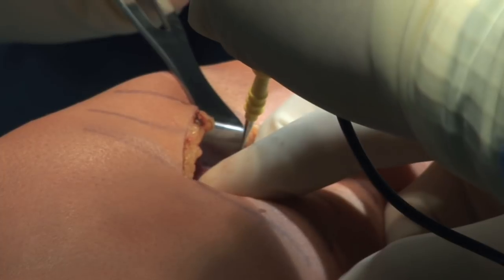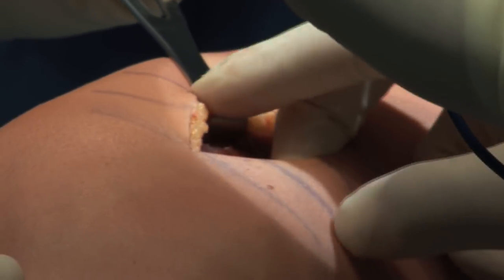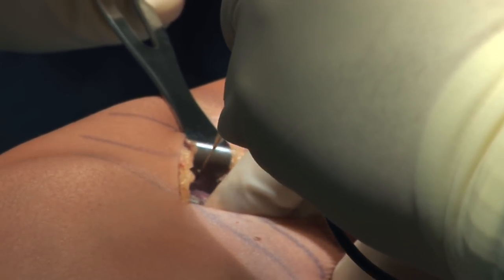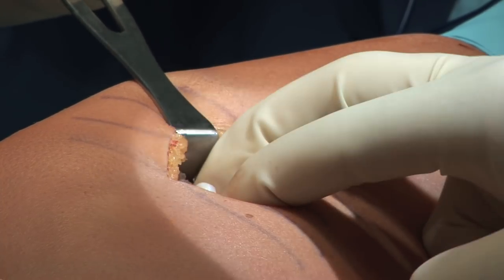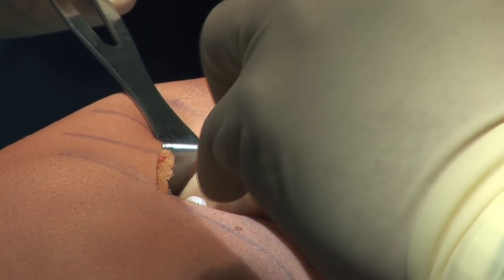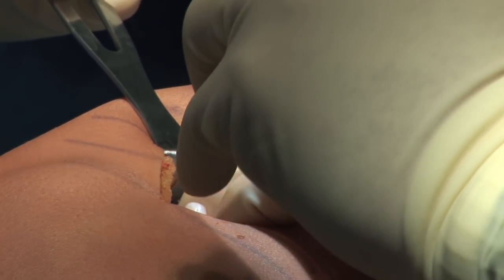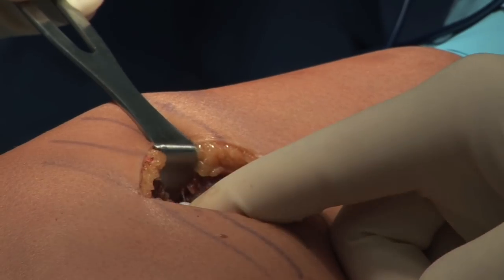The cautery is used to separate some of the fibers of the vastus medialis just over the cartilaginous cap. The capsule of the osteochondroma is visible in this portion of the video, and the cartilaginous cap will be coming into view momentarily. This is the osteochondroma.